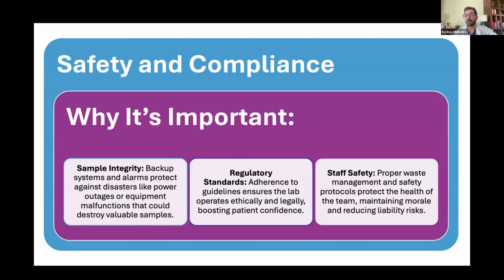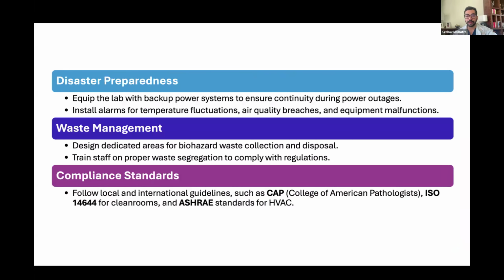And obviously, you want to think about staff safety, especially, I'll give you an example of the cryo room. It should be ventilated, should have an oxygen sensor, and should be spacious enough for the embryologist to work properly without damaging the cryo tanks, etc. So certain things, if thought of beforehand, can really help us in improving our workflow and improving the management within the IVF laboratory.